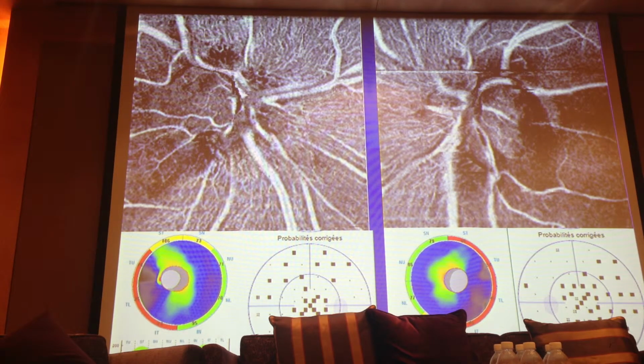Michelle, also, I know that in glaucoma, a lot of times the lamina cribrosa actually bows downwards. In your experience, is the angio view able to segment and go into the deeper layers, or does that turn up as an artifact in a lot of cases? Around the disc, we have an artifact with the big vessels, so it's difficult. We can go deeper, but it's not so relevant.